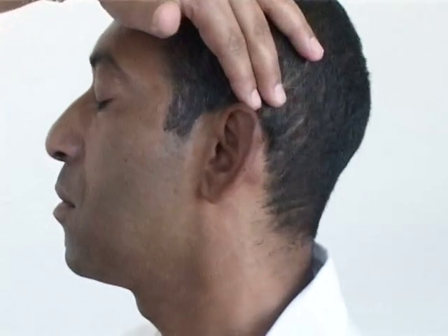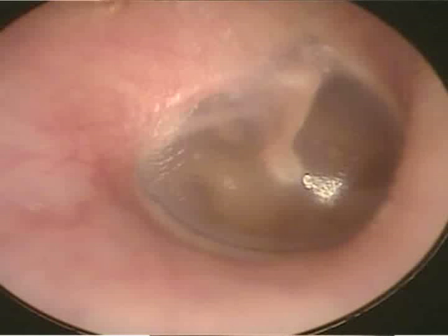When we do the inspection of the tympanic membrane, we must look for the following normal findings. The color of the tympanic membrane is supposed to be pearly gray, shiny, and transparent. We also look to see if there are sections of the malleus bone visible. The malleus bone is attached from the inside of the tympanic membrane in the middle.